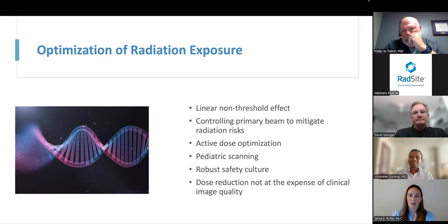It's been really exciting on my end to see the difference in orthopedics when we now have an imaging modality that offers the diagnostic and alignment information given to an orthopedic surgeon when the patient is standing. It's almost the opposite of David's compression in mammography. Orthopedic surgeons have had to compromise: it would be great to get 3D information, but I lose all of that functional weight-bearing alignment as soon as I lay that patient down on a table. Now they're getting the 3D information and the weight-bearing alignment information in the same study, so they can be much more precise in their surgical planning.